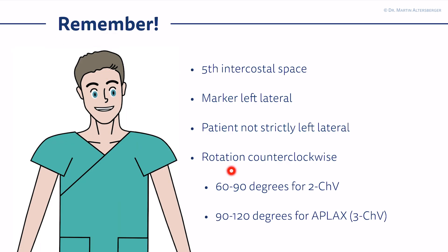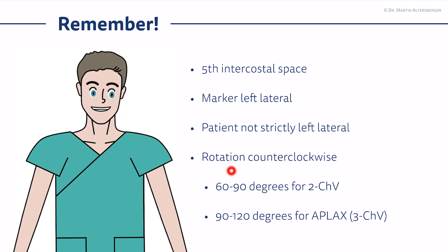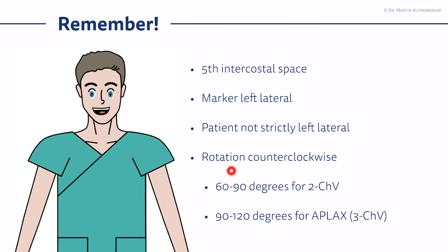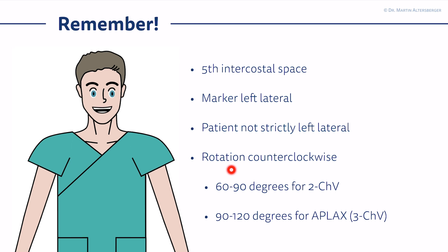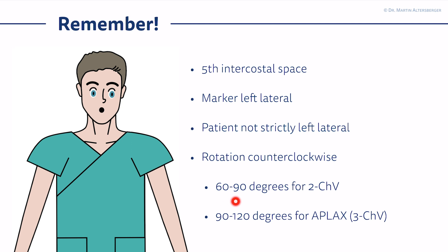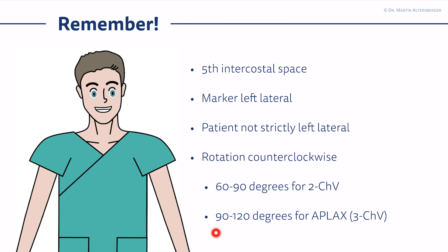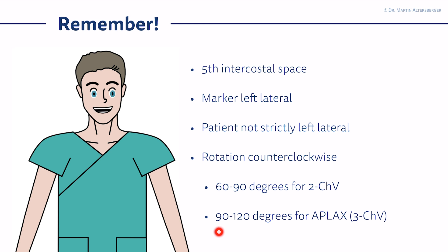Remember: fifth intercostal space approximately — go to the point where you feel probably the heartbeat or where you simply see the left ventricular apex, the marker left lateral. The rotation counterclockwise for the two-chamber view is 60 to 90 degrees from the four-chamber view. For the apical long axis or three-chamber view, it's 90 to 120 degrees.